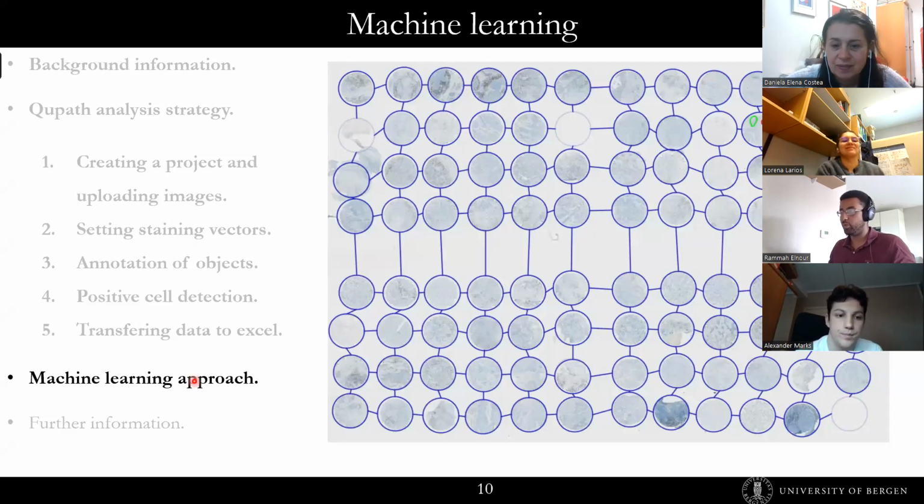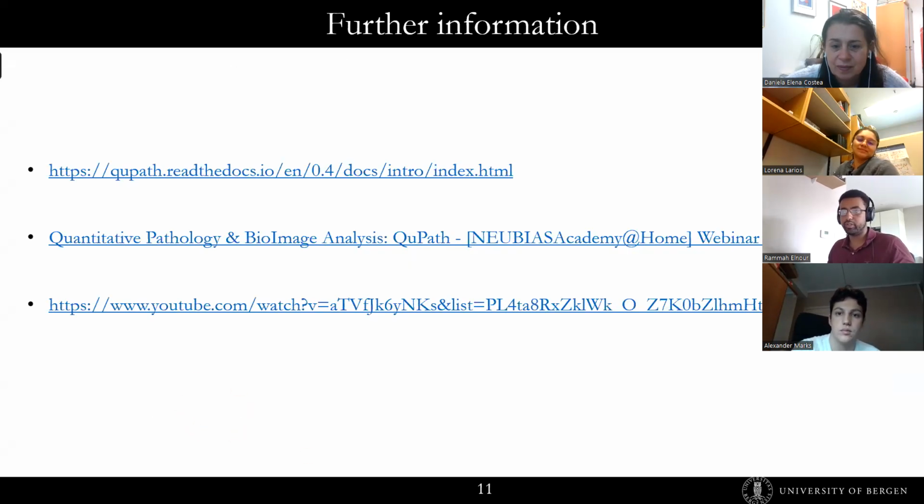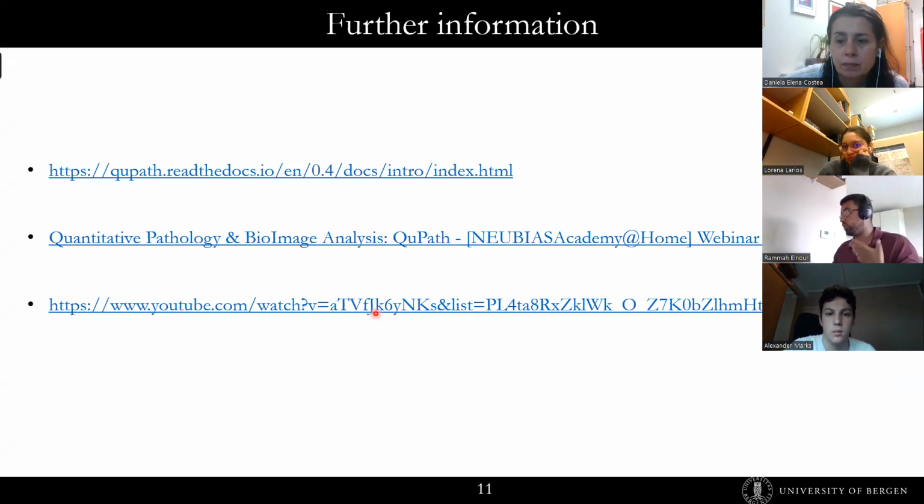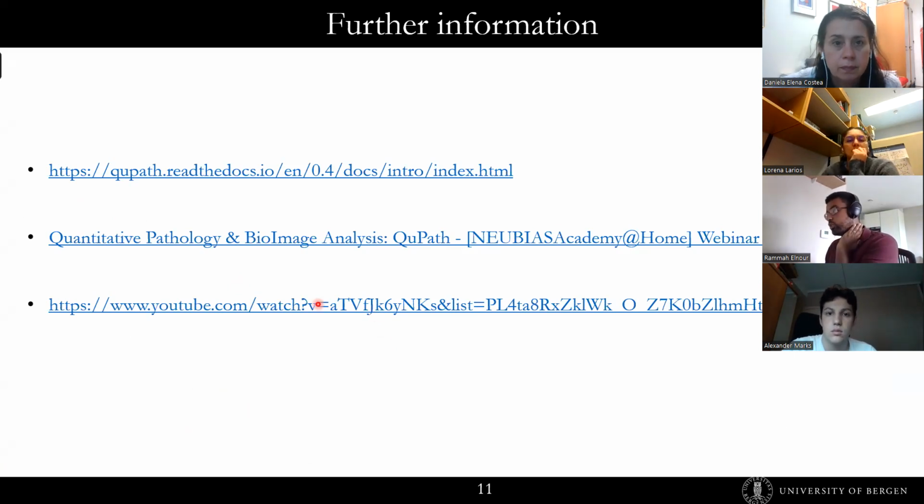But what I wanted to say finally is that if you wanted further information about QuPath, you can go on YouTube and Peter Bankhead has a pretty good tutorial on how to use it. So on YouTube, you can follow that tutorial. It is a bit outdated. QuPath has been updated quite a lot since then, but I think it's still a very good way to start when you want to get into it.